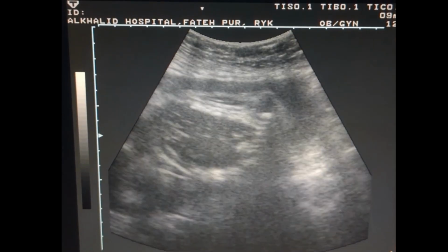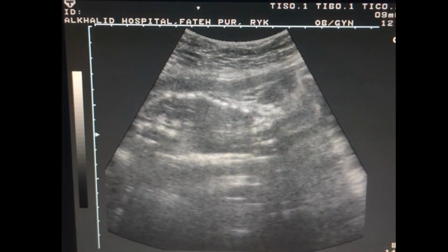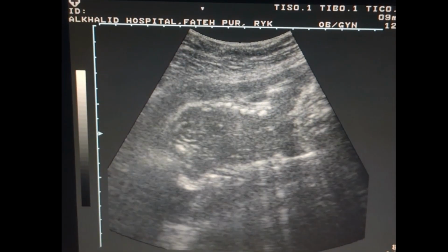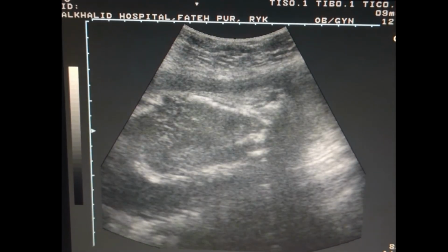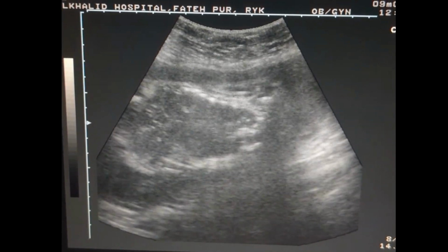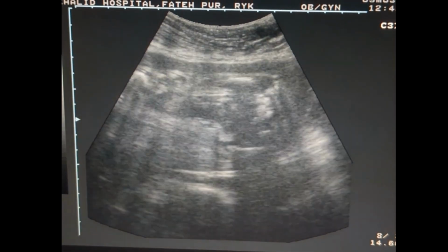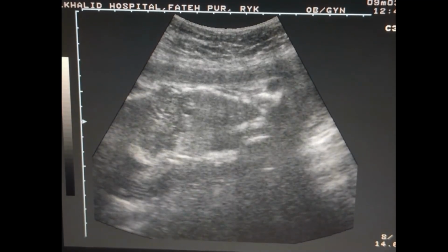The femur of the fetus measurement shows 28 weeks, and fetal BPD, biparietal diameter, shows a fetal gestational age of 23 weeks. Because the bones are collapsed, BPD shows a difference of 5 weeks from the fetal femur.